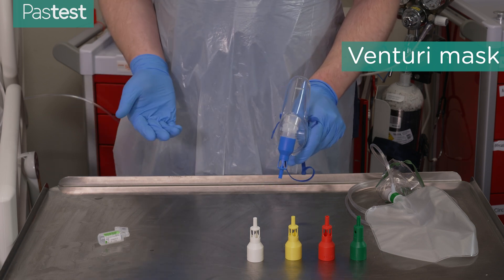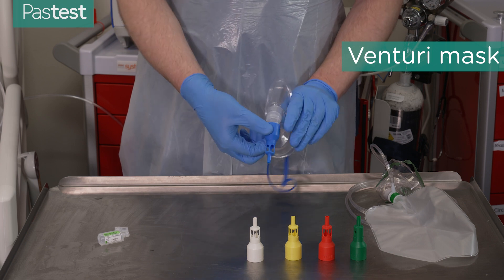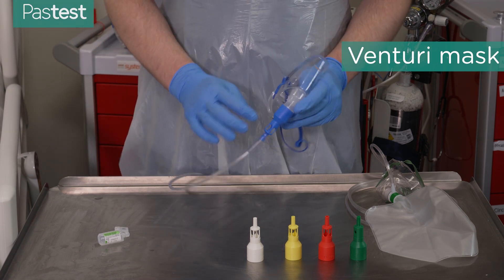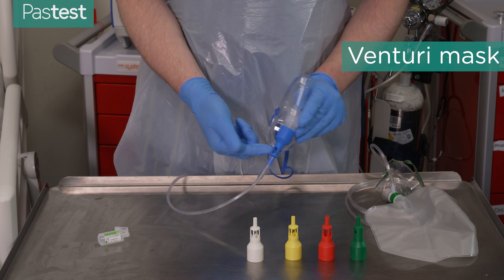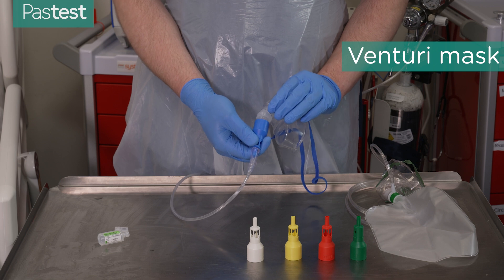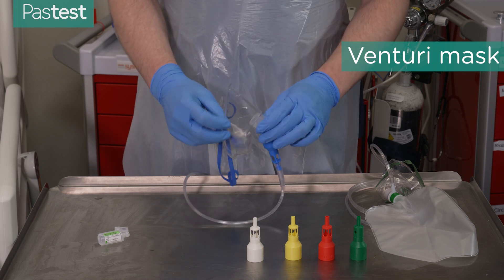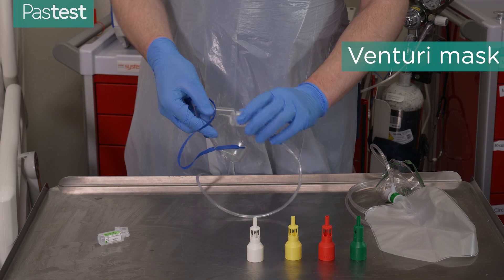This works much like the simple mask — you put on the attachments and connect your oxygen. It's really important to understand that these will only work as labelled at the specified flow rate. Any less, it won't achieve the written oxygen concentration; but also any more, it won't go above that concentration. Once set up, you turn the oxygen on and place it on the patient to cover their nose and mouth.